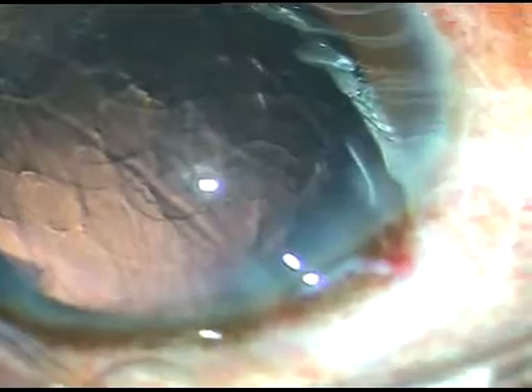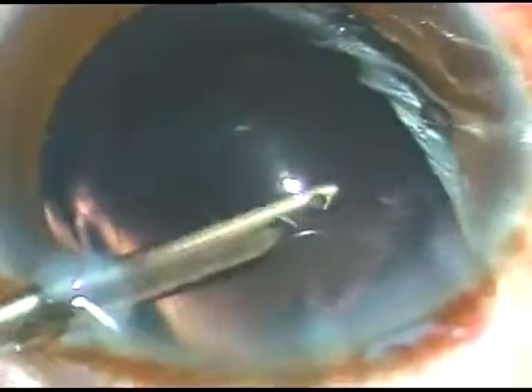Now I inject a little bit of viscoelastic substance and whatever little cortical matter is there is removed. This is a 23 gauge Simcoe cannula — I like this instrument instead of a coaxial irrigation-aspiration device.